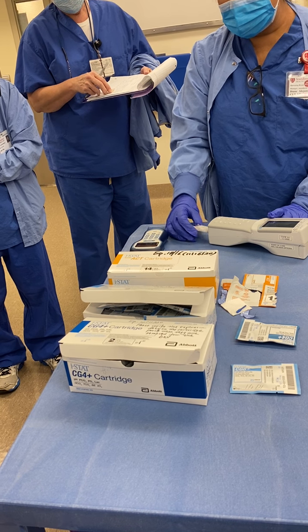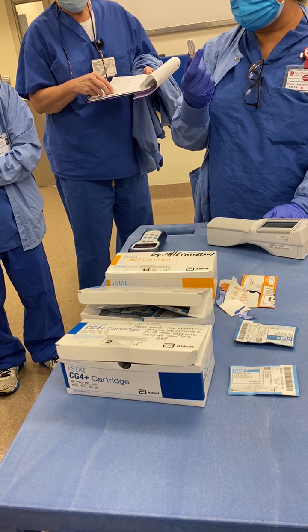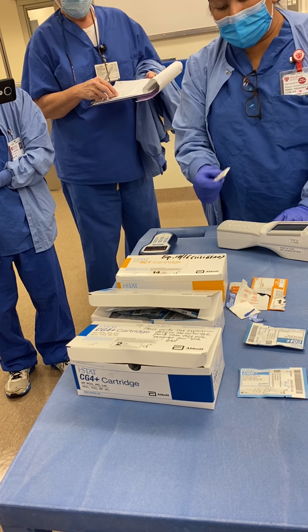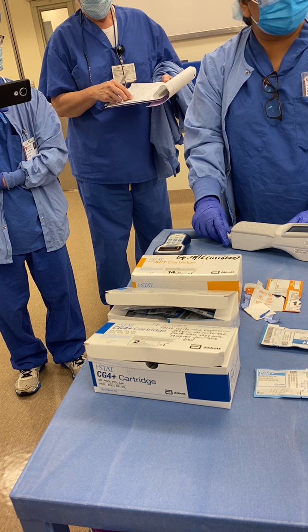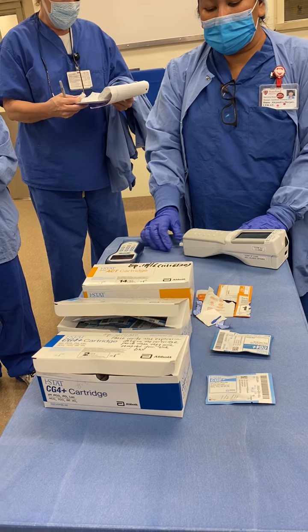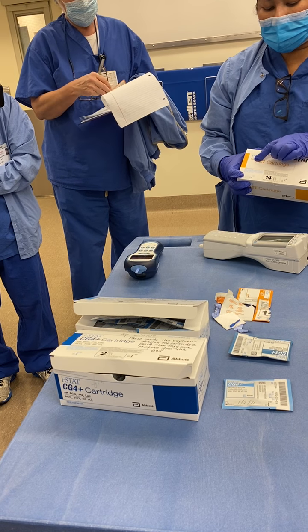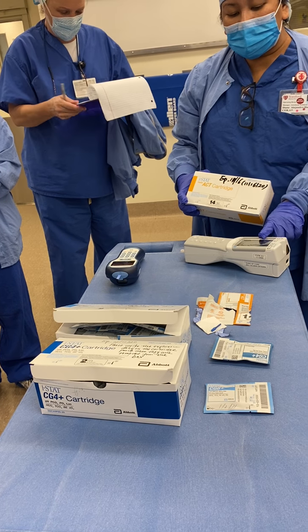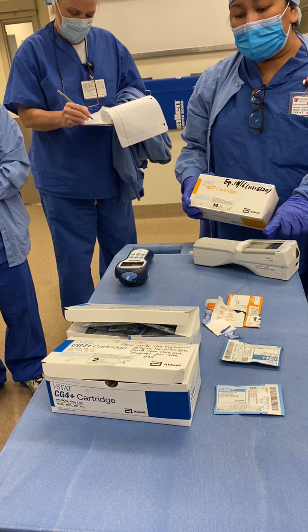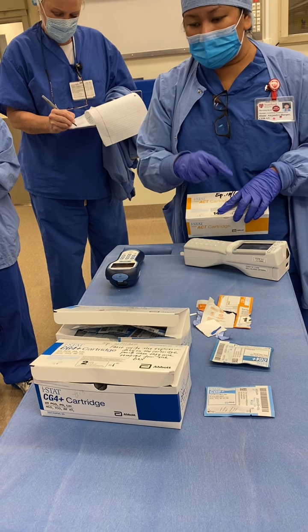a result. So activated clotting time, really quickly, does anyone know what that is? What is the purpose of finding the ACT number of the patient? See how quick they're clotting? They could bleed out. ACT is activated clotting time. It will give you a value in seconds. It will tell you how many seconds it takes for the patient's blood to clot.